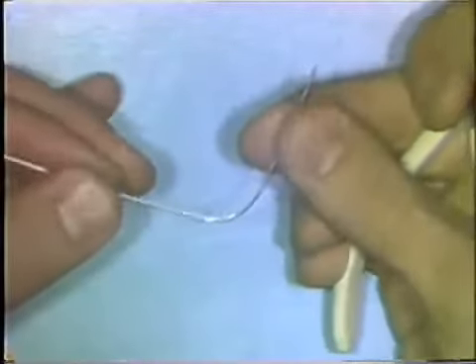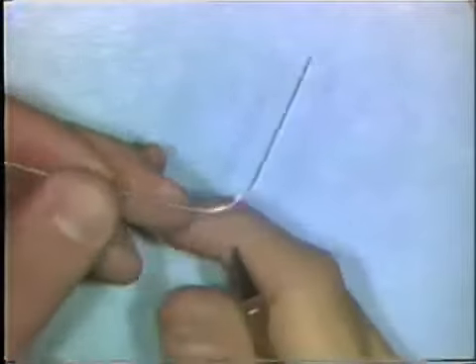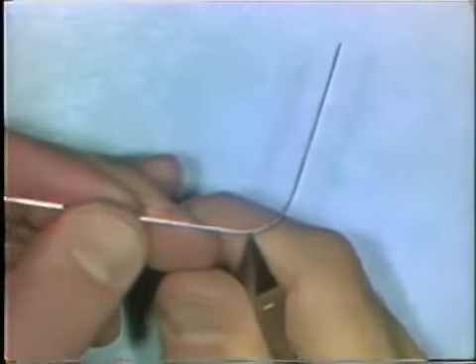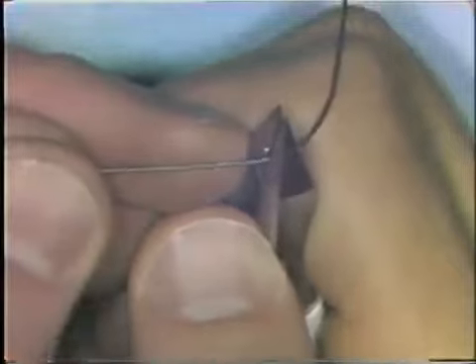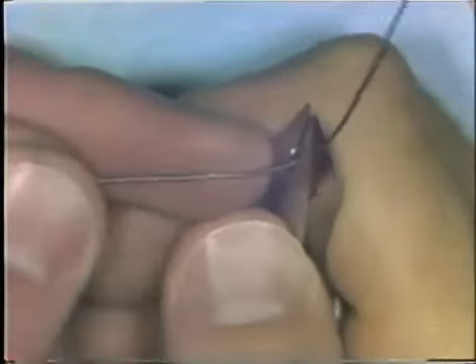To adjust a curve to make it fit the arc that you'd like, you sometimes have to flatten out areas that are overly curved, such as this spot right here. You do that by placing the curve in the flat base portion of the pliers and squeezing it. And this will open up the curve a bit.